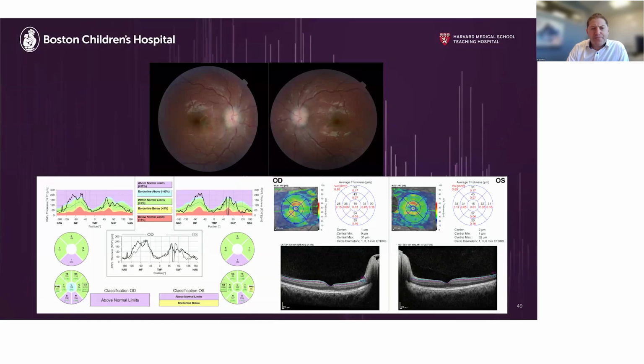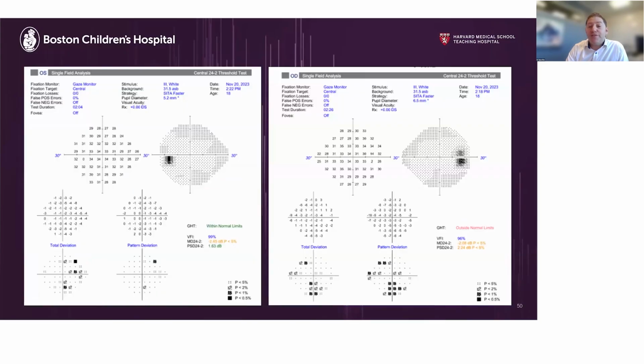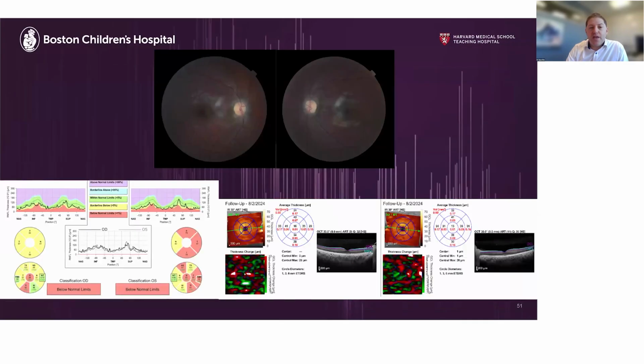Here were her optic nerves. They just look a little bit different than they had to me a year before. Her ganglion cell layer is still roughly the same at 0.88, 0.89. Her optic nerves, if you just look at the colors, 116 and 102, look pretty normal, except that a year before, her optic nerves were in the 70s and 60s because she was atrophic. Her visual field was essentially normal, some nonspecific defects.